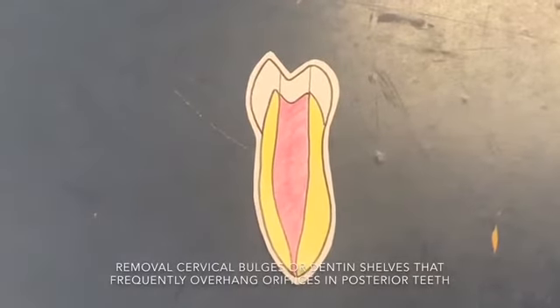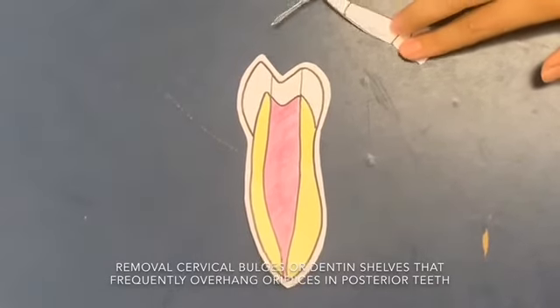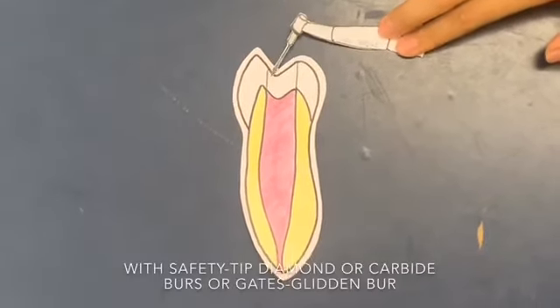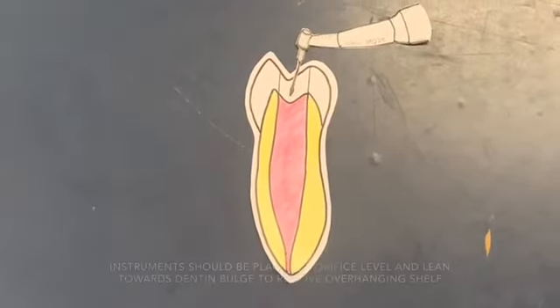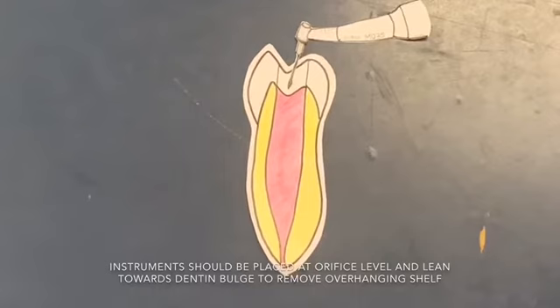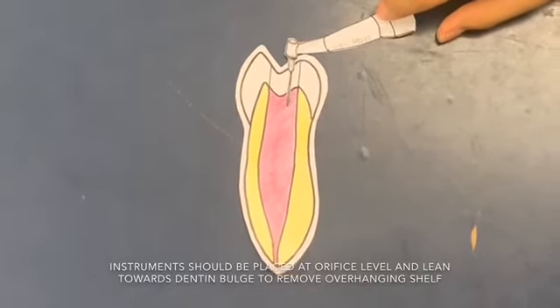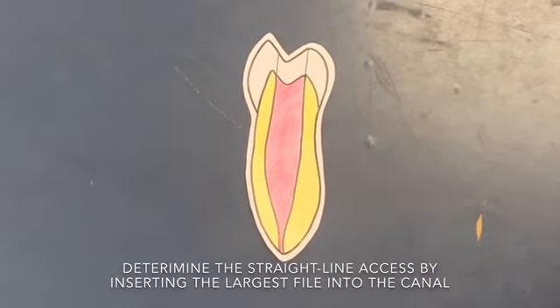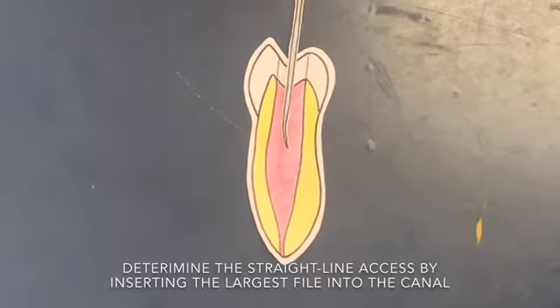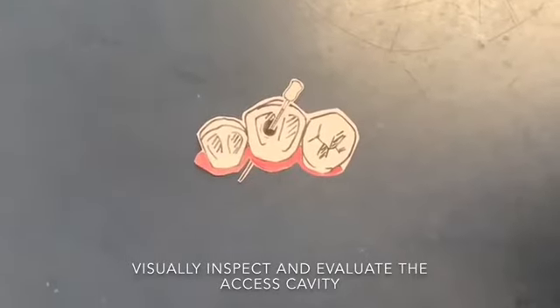Remove cervical bulges or dentin shelves that frequently overhang orifices in posterior teeth with safety tip diamond or carbide burrs or Gates-Glidden burrs. Instruments should be placed at orifice level and lean towards the dentin bulge to remove the overhanging shelf. Determine the straight line access by inserting the largest file into the canal. Visually inspect and evaluate the access cavity.